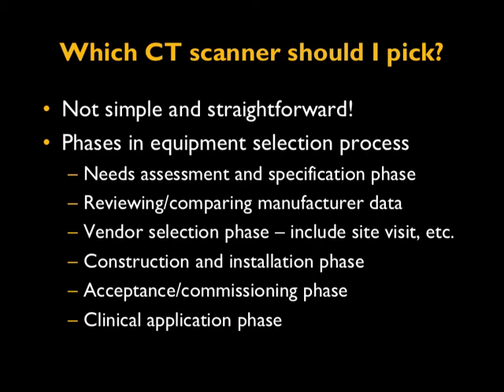They need to review and compare the data from a few different manufacturers, which is usually followed by the vendor selection phase. This also includes site visits, talking to other sites that have a particular piece of equipment, followed by the construction and installation phase, and the acceptance and commissioning phase. Then starts the clinical application phase.